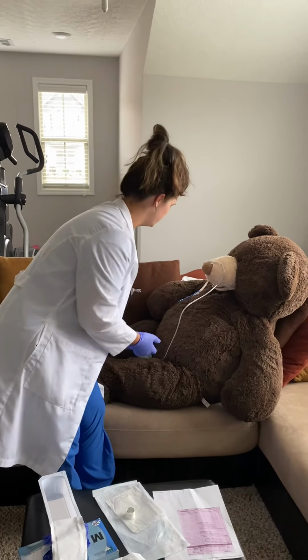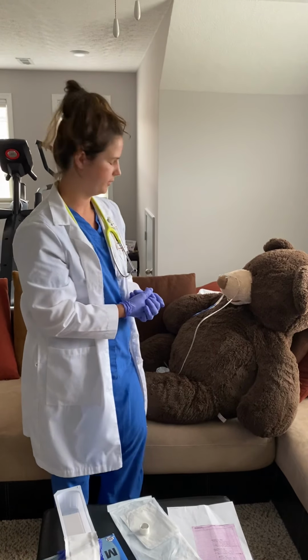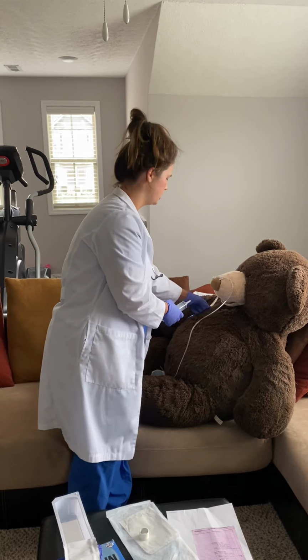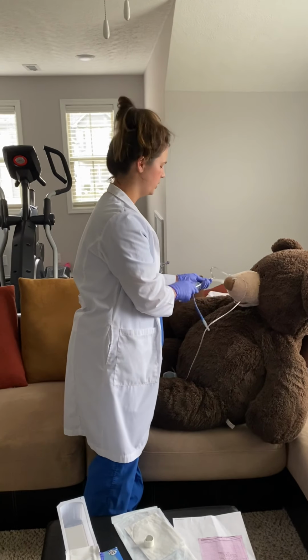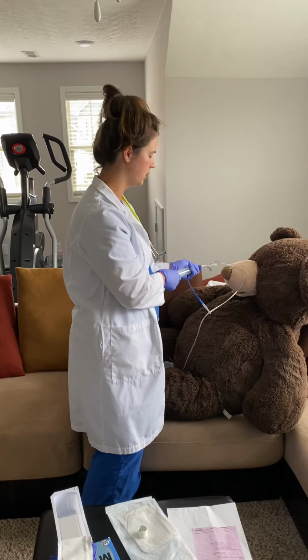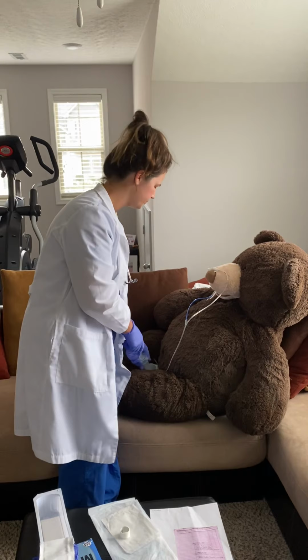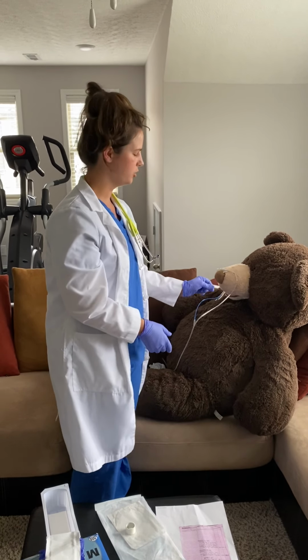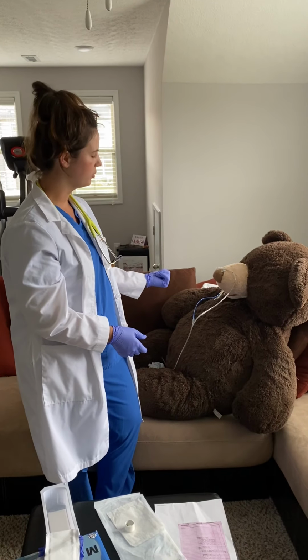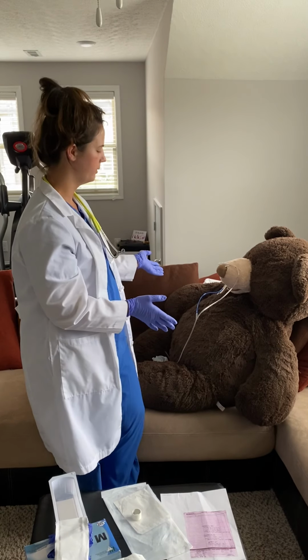So after you check the residual, you're going to push the fluid, so 50 mLs you're going to flush with, and then you're going to hook up their feeding. You want to check the expiration and the integrity of the Glucerna before administering it, and then flush again after the feeding. And then you want to clamp your tube once you're done with the feeding and the flushing, just so that the feeding doesn't come back up. And you want to make sure your patient tolerated it well and that they're comfortable before leaving.